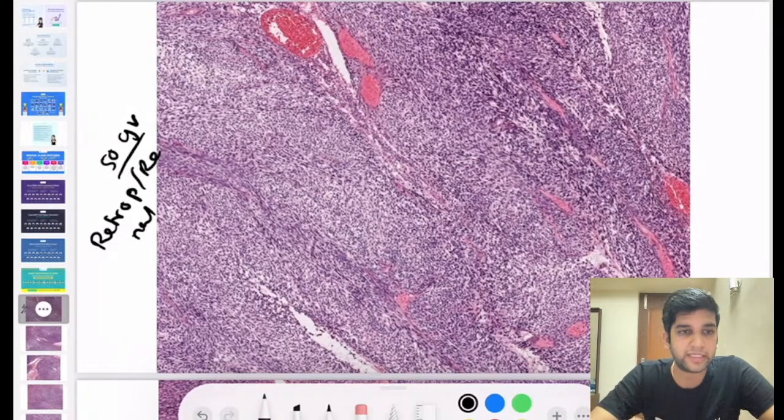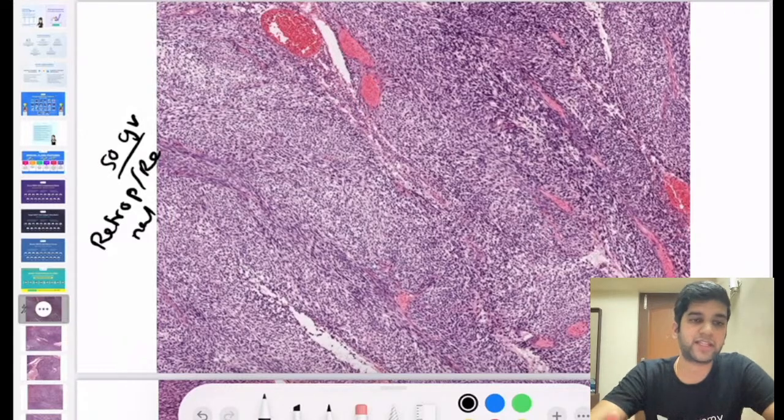So comment on it like we did for the last class. I'll be going with a 10-second pointer for each of them. Comment whatever comes to your mind, then I'll discuss them and tell you what IHCs I have put forward, and let's see what happens. Fine. Every 10 seconds I'll change one image, so just look at them like you guys did yesterday.